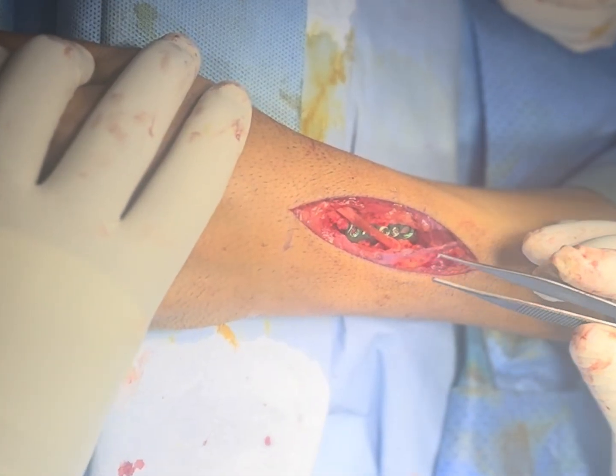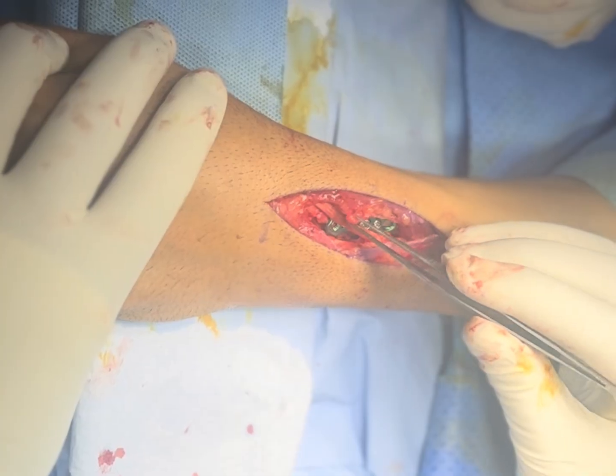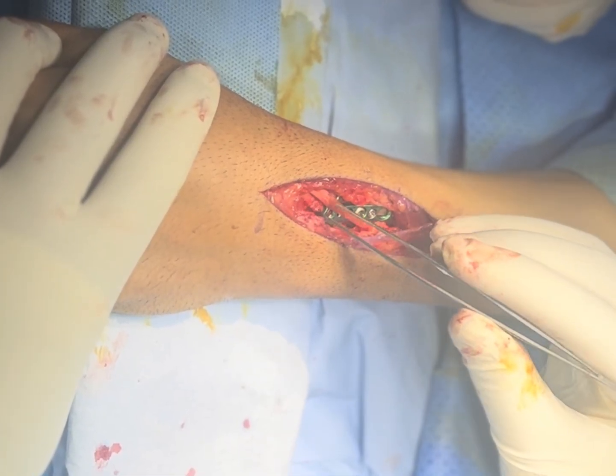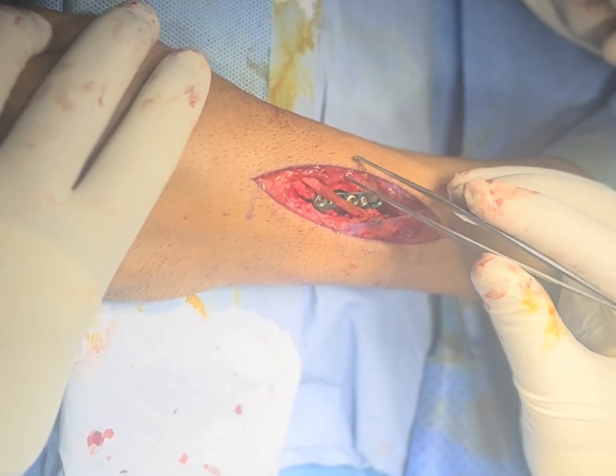We have placed the plate. This is the EPL tendon — we are going to close all the dorsal compartments and then put the subcutaneous tissue and skin.